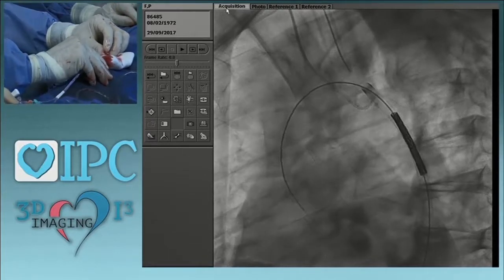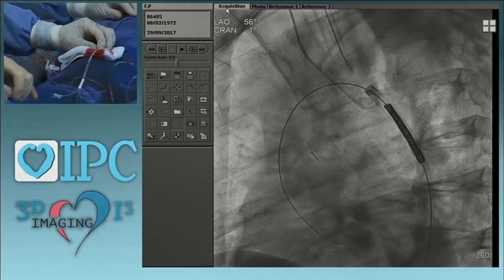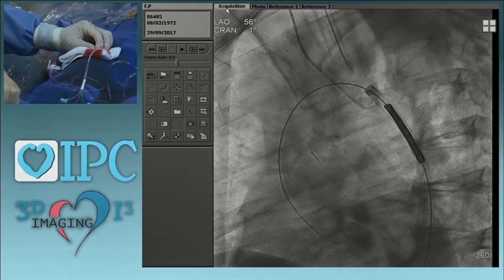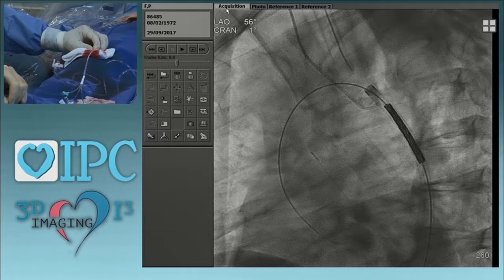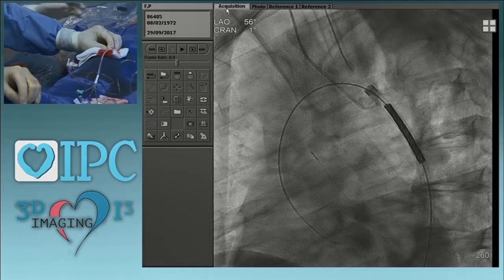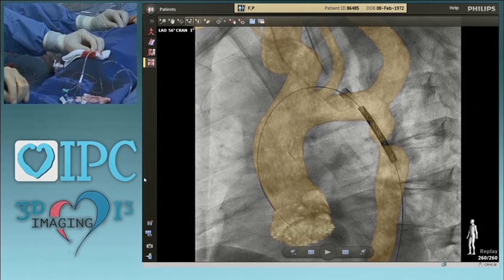Yep. Let's have the iPilot for the audience. Yeah, and for us too. We do have the iPilot here. We fused the images with the angio, and I don't know if you are able to see iPilot on the screen in the main audience. Just a comment. Probably not yet. He's coming. Yeah, go ahead.